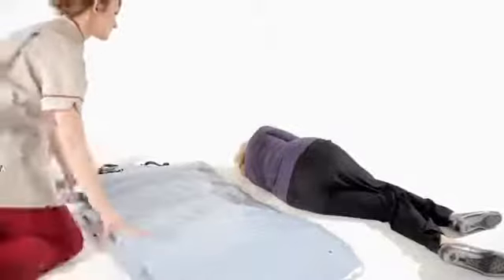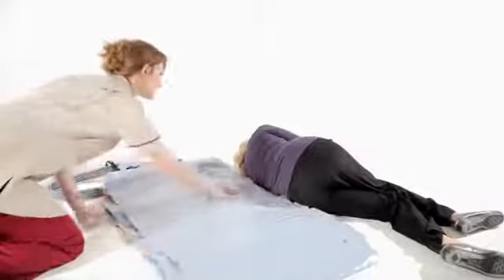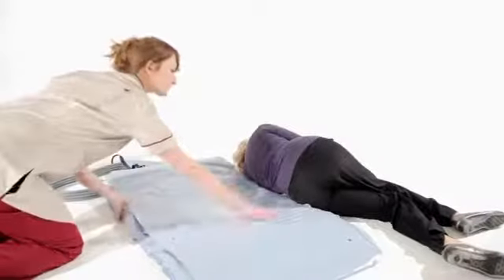Ensure that the backrest is folded outwards. From the recovery position, the carer places the camel directly behind the person with the camel badge in line with their head. The carer should then position a slide sheet lengthways under the person to enable them to be easily manoeuvred onto the camel.